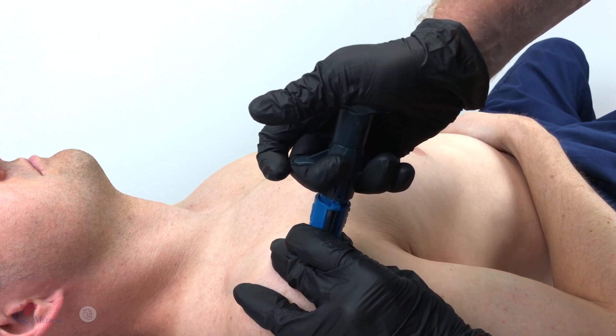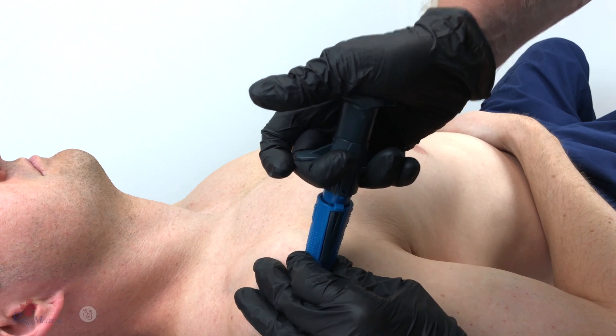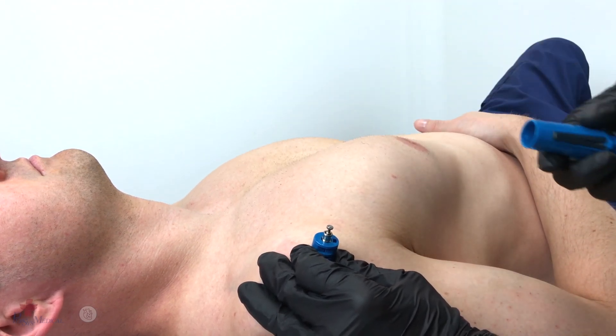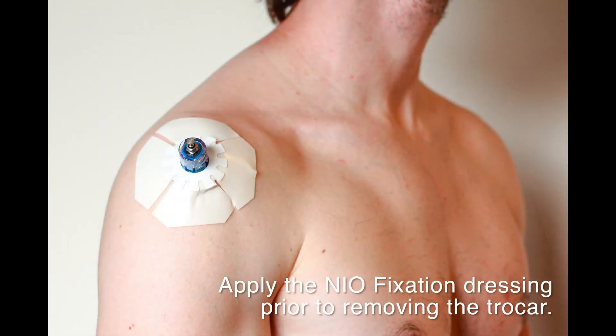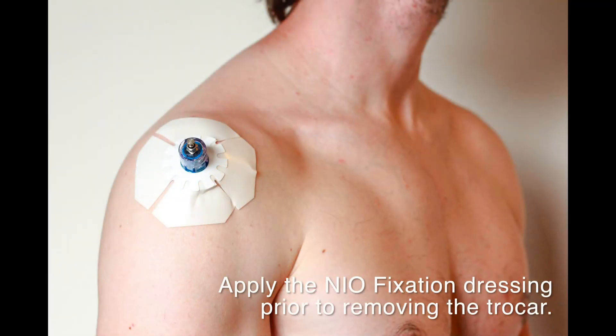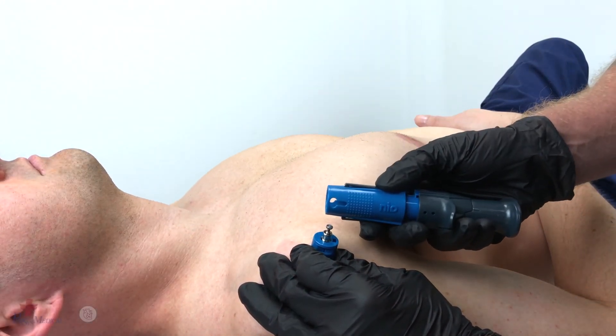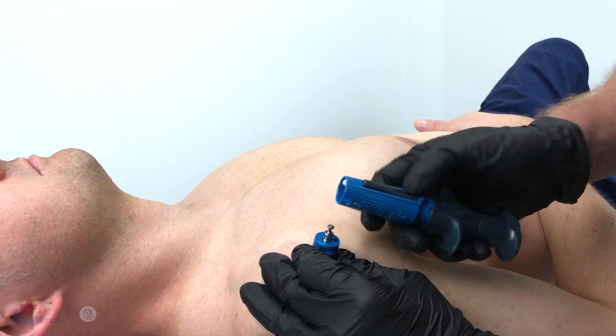Once the Neo has deployed, remove the device while leaving the stabilizer base in place. The trocar can now be removed either by hand or utilizing the trocar removal notch.